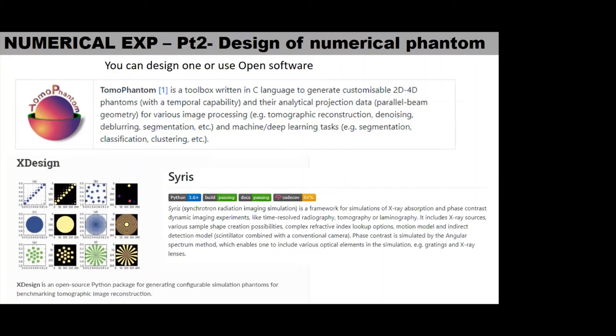I mean, how do you make it much more, because they're also looking at the cost. Because I'm having maybe five sources, CT sources, of course. You're also going to look at the detectors arrangement. How is every one of that going to play out? In fact, the use of this dual energy, right from the mid 70s, in the Hounsfield space, they actually did something on that, but it's not been developed until recently. I want to believe it is just because of the technicalities involved and maybe algorithm development and all that.